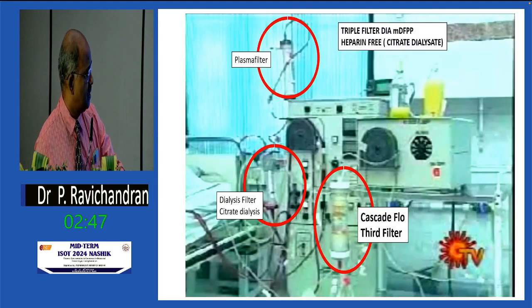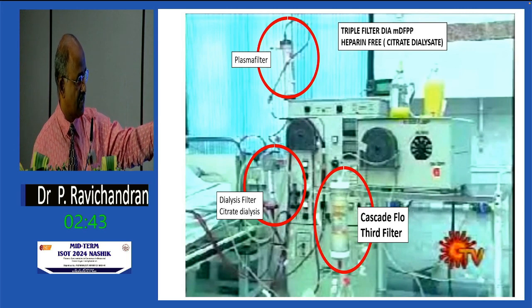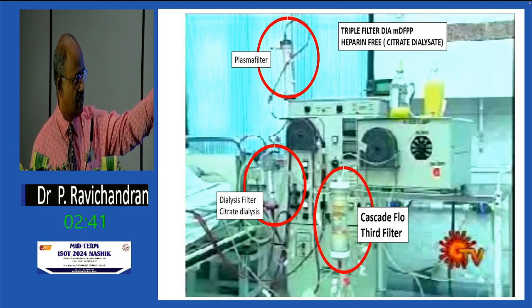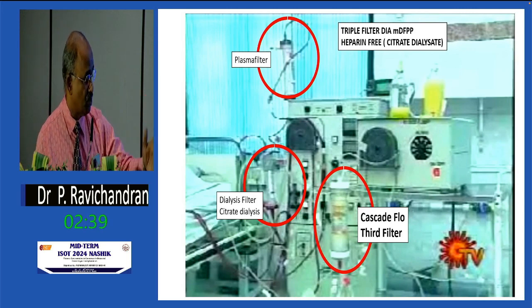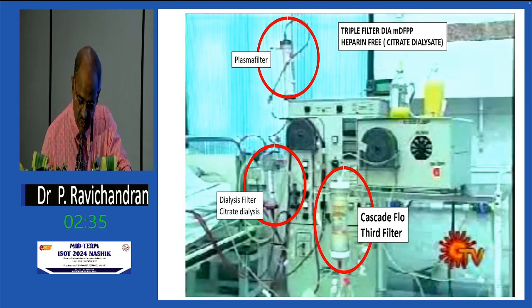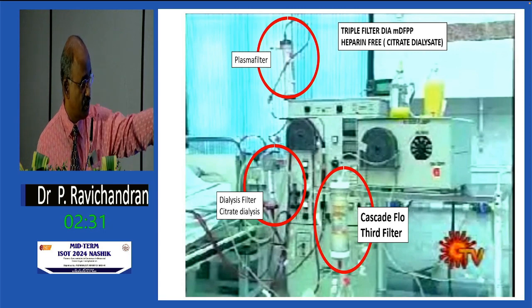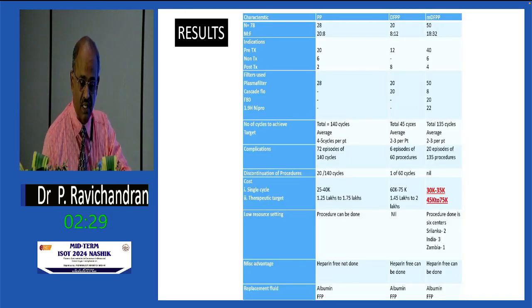So this is the dialysis filter connected to a plasma filter, and then comes the cascade flow, and the discard is the one which is removed. So this patient was in post-op condition, but in those days, 2004-5, we had more difficulties and we were using Cobe machines and separate things.